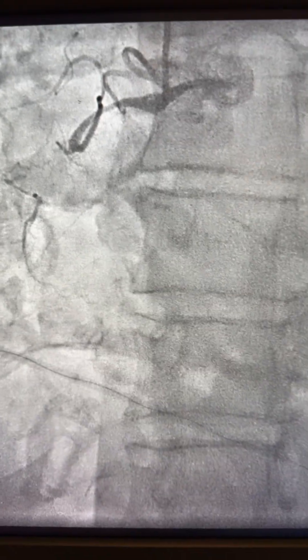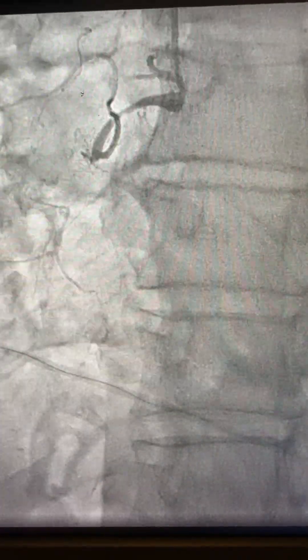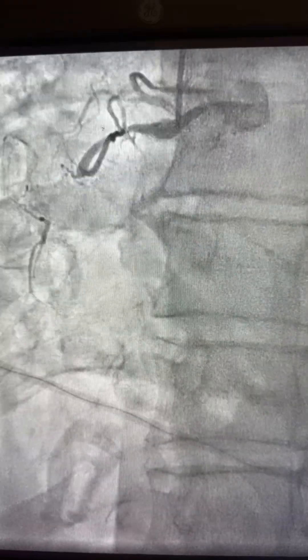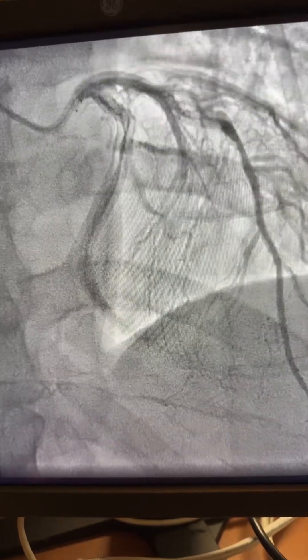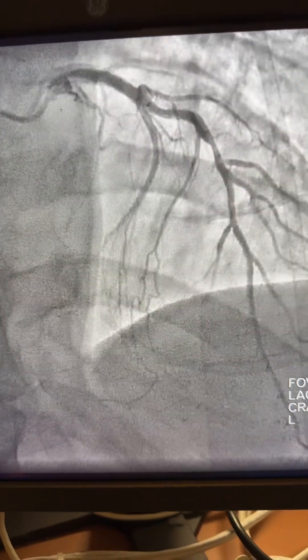When you have a CTO case with a blunted cap and two side branches, it will make it very hard to wire through the true lumen. This case was referred for CTO RCA, non-CTO, with left-to-right collaterals.